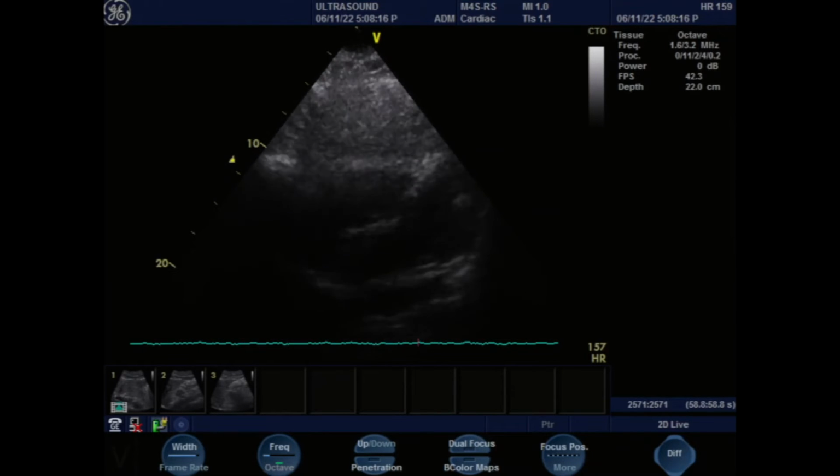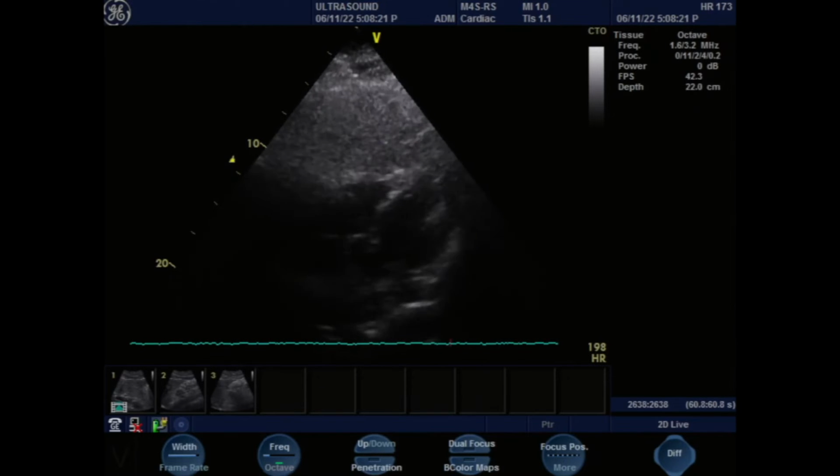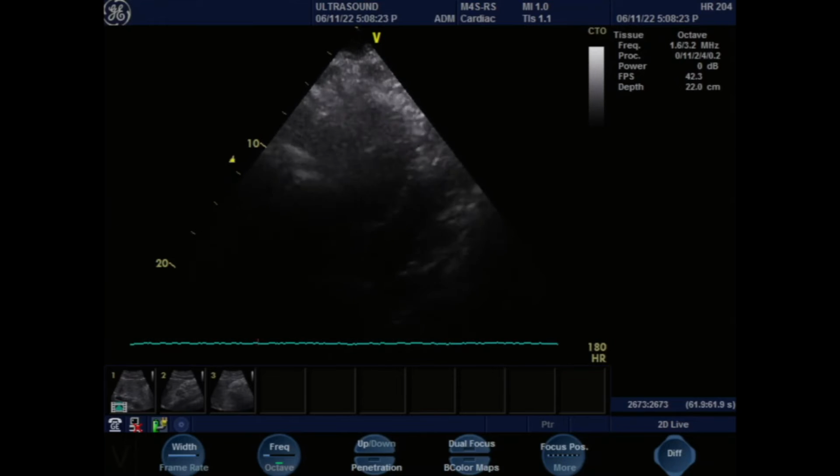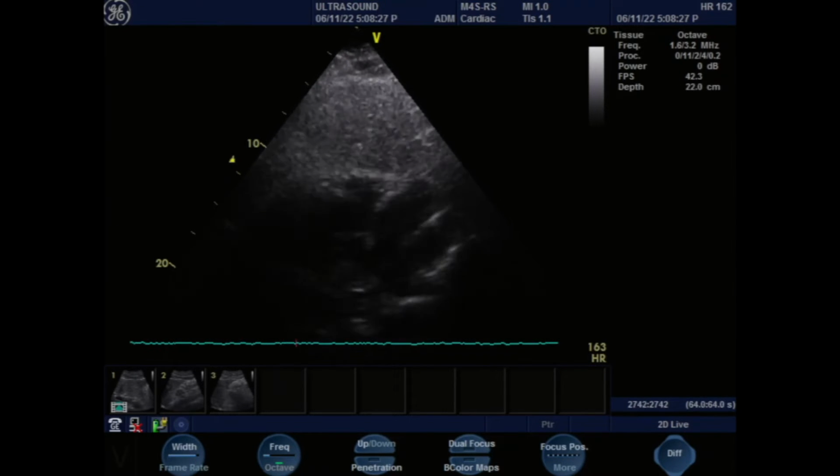Would you say that's like a coronal? This would be coronal equivalent, yes. Just so that people can understand, yes, it's a coronal equivalent. I wish I had brought a hard model. Next time we'll bring a hard model, so it'll be easier to see what they're looking at here.